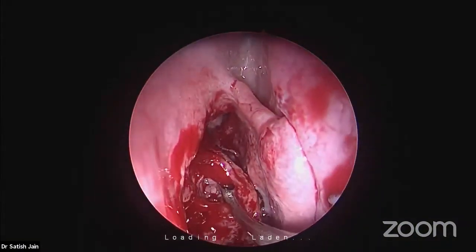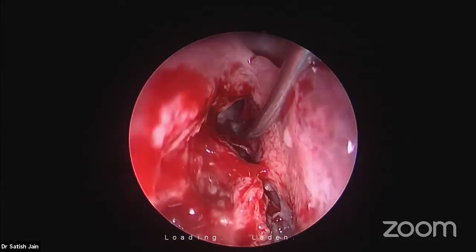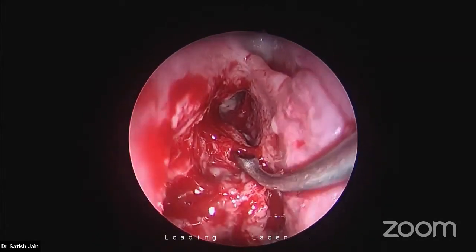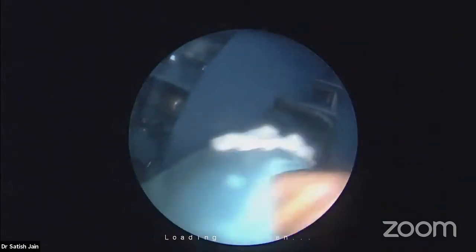This is the bulla. I did not remove it and did the frontal sinus job first because the bulla itself protects the anterior ethmoidal artery from the surgeon. That's an additional protection.